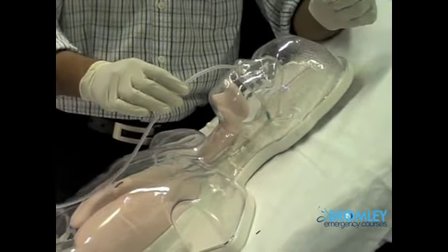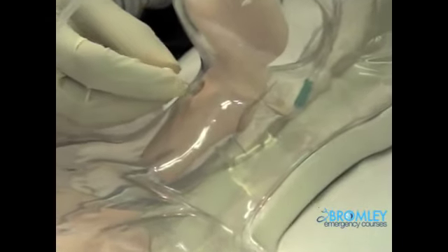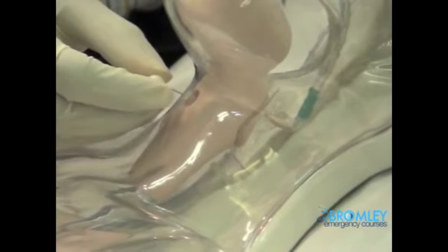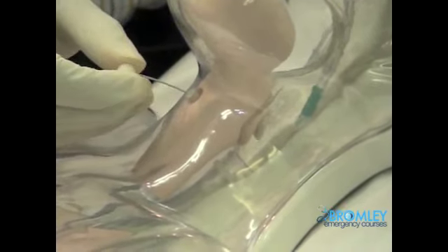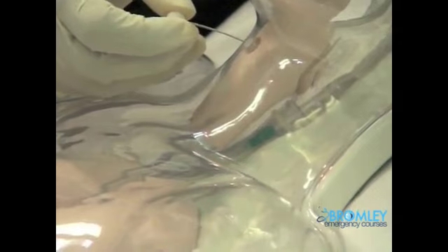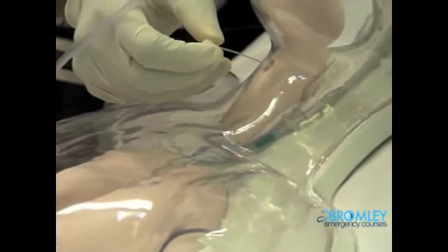So as you can demonstrate on this mannequin here, once it reaches the pharynx, the epiglottis, which is the movable part of the mannequin, if the patient swallows, it closes the opening of the trachea, and then it helps the NG tube into the esophagus. So the patient keeps swallowing, the glottis keeps moving.